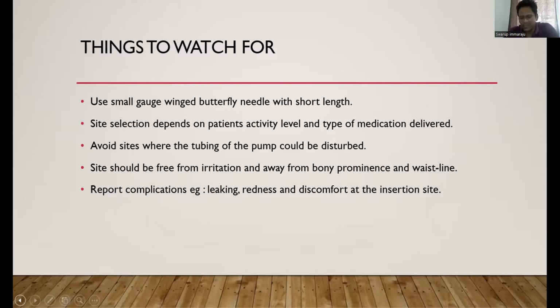If the patient is in a delirium state or is confused, trying to pull out everything on his body, whether the IV cannula, the catheter, the Ryle's tube, or the subcutaneous port, the scapula is the best site. Both sides of the scapula are the best site to fix the subcutaneous port. A port is nothing but the subcutaneous cannula fixed over that area. We call it IV cannulation for an IV port, the same as the subcutaneous port. A port is something placed for a period of time. That's nothing but the port.